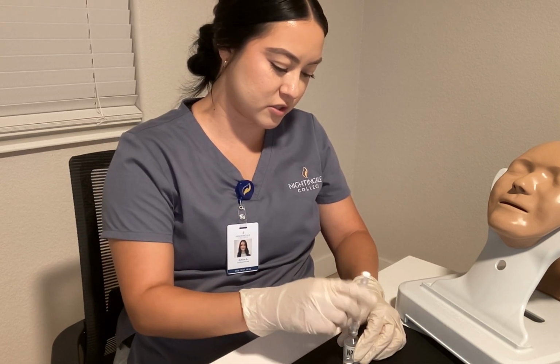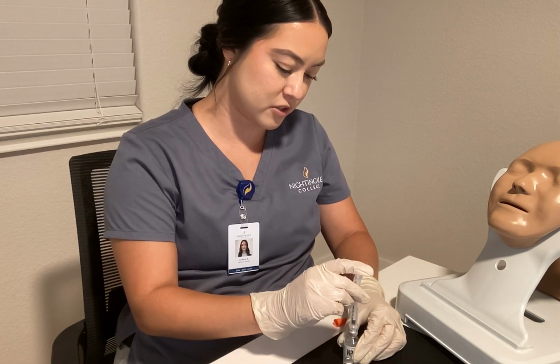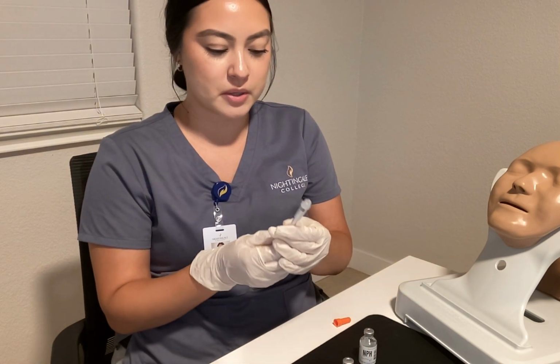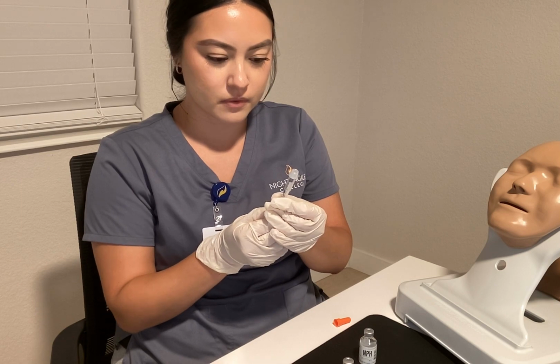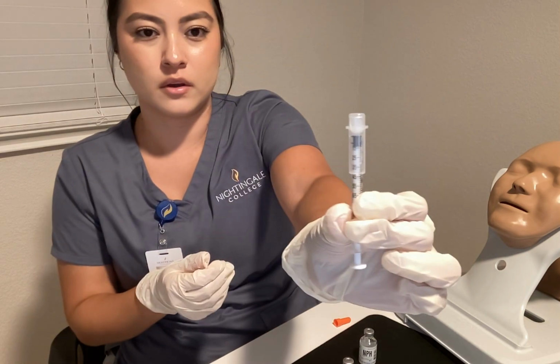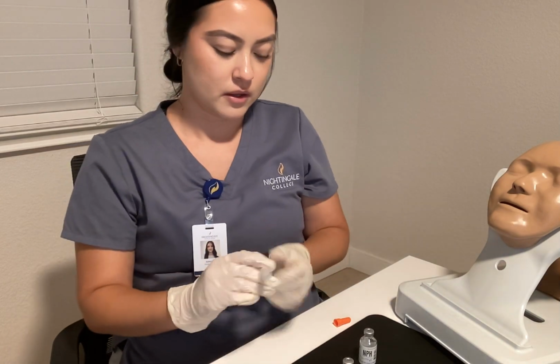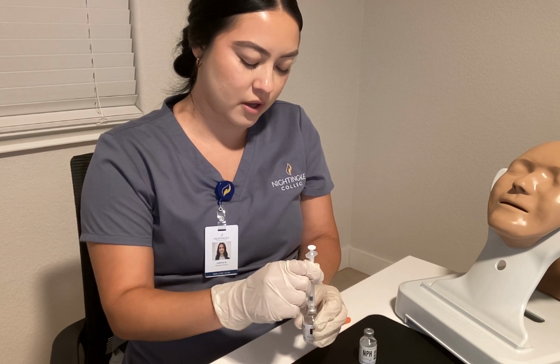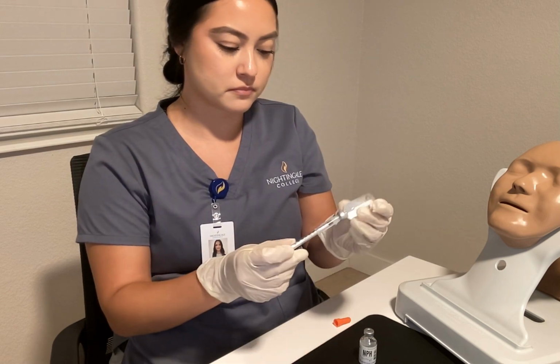And again, we're just injecting air, we are not drawing up medication. And then for our regular, this is going to be 4 units. Our 4 units. And after we inject the air, we can go ahead and draw up our medication.